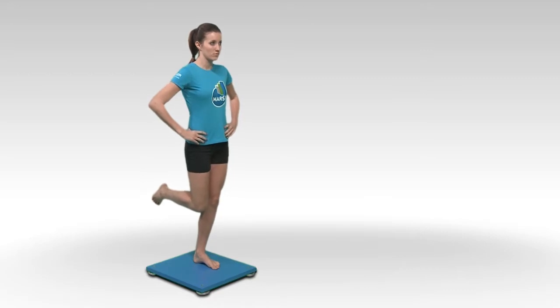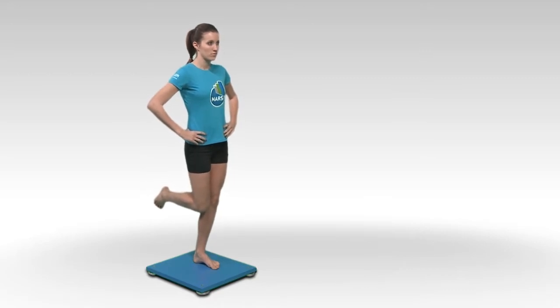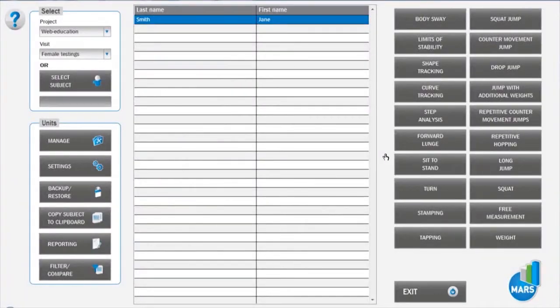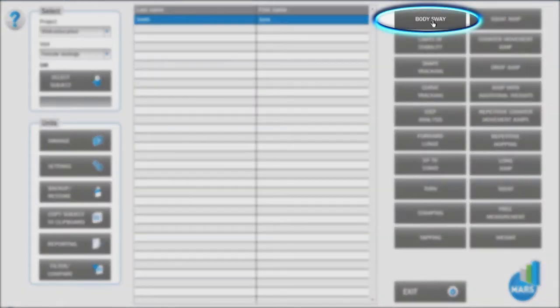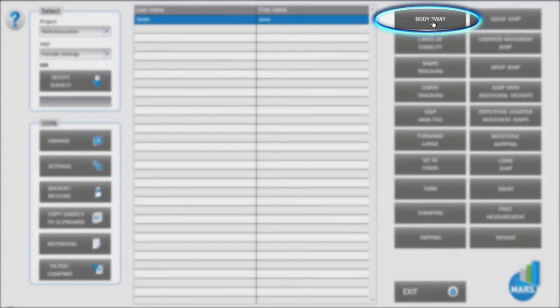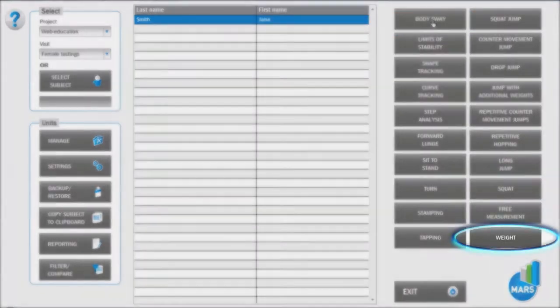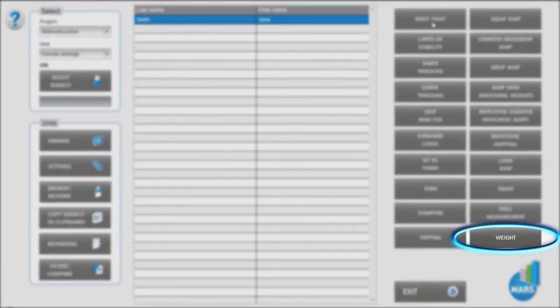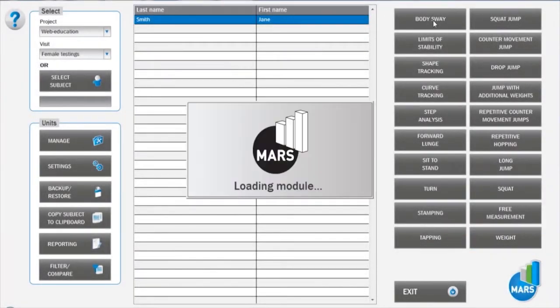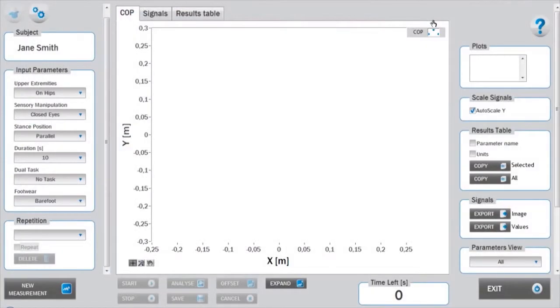Enter the body sway test module from the main window by clicking on the body sway icon. Make sure you have acquired the subject's body weight beforehand.